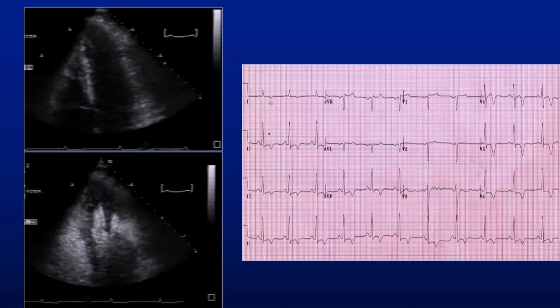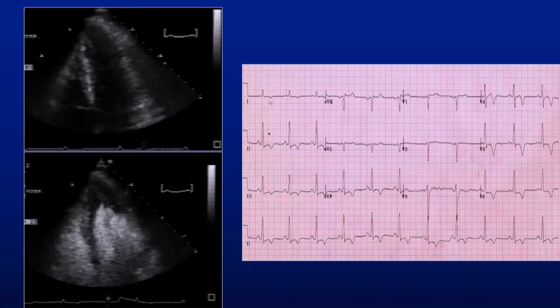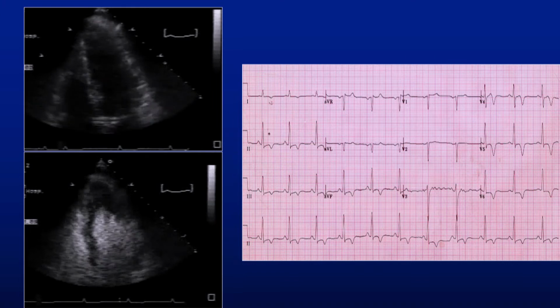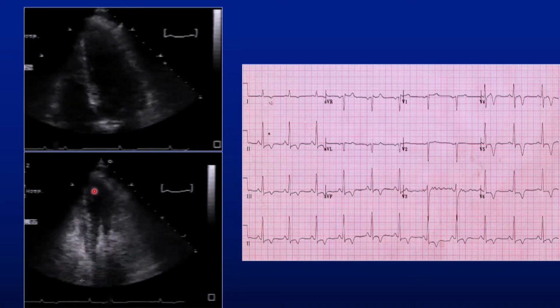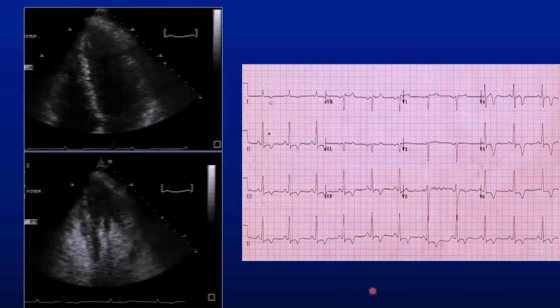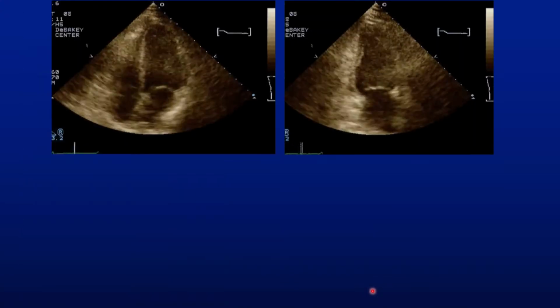All right, so this is that patient. What is that? That's an apical hypertrophic cardiomyopathy, indeed, with at times maybe a little sequestration of an apical cavity that you see from time to time, a little tiny one, but certainly an apical HCM, which goes along also with that electrocardiogram. This is your major differential in those situations, okay? How about this case?